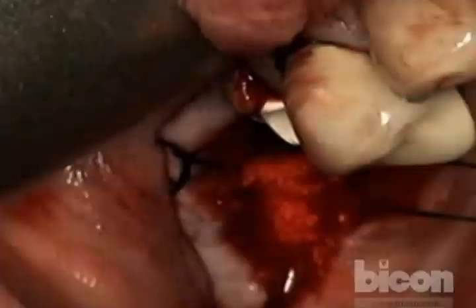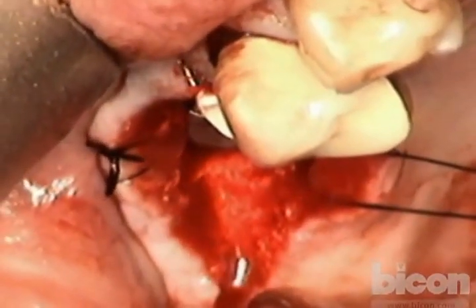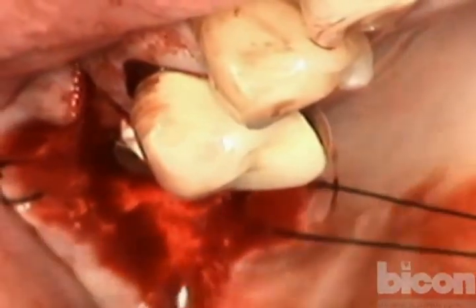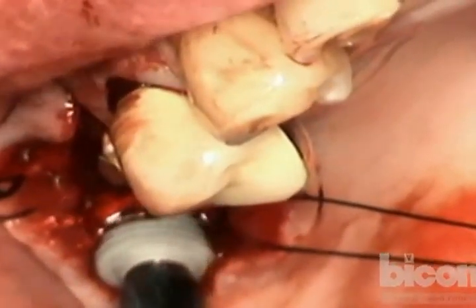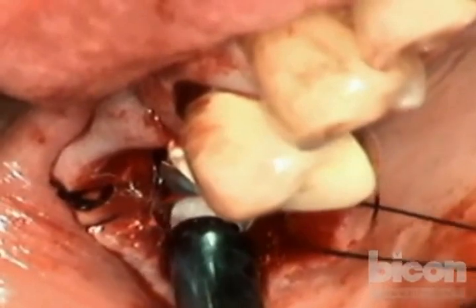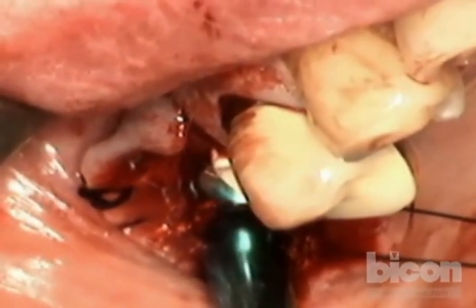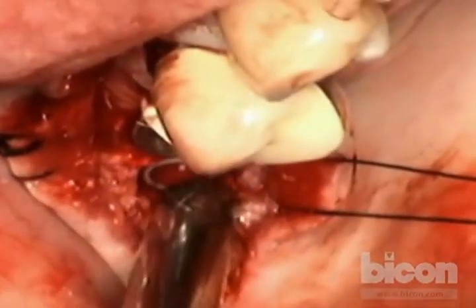Now we'll move to the distal implant, the implant at the second molar, and that will be a wider implant because we have the width. And that will be a 6 by 5.7 millimeter implant. We will place that now as well, using the inserter retriever. This one had even more depth. Okay, perfect. Mallet, okay. This one will have enough friction of its own that I probably won't need the sinus lift abutment. And I put it to the full depth now, I think at least. Now let's double check it. As you can see, it is nicely placed. I will place it a little bit deeper.